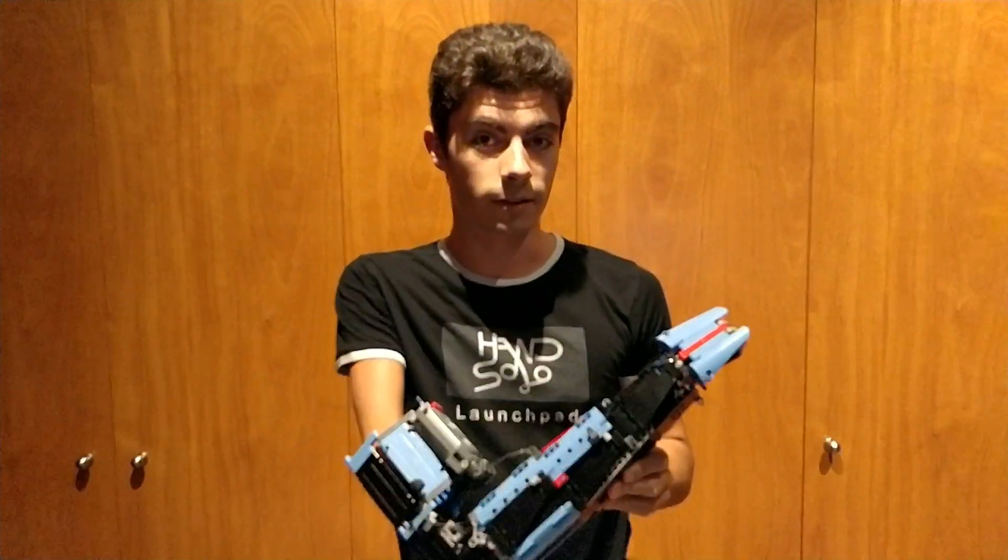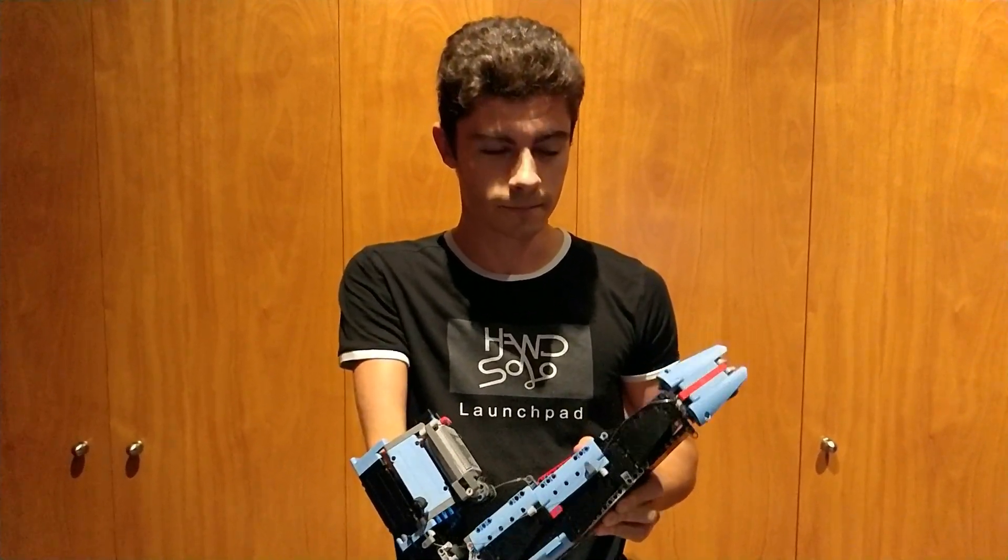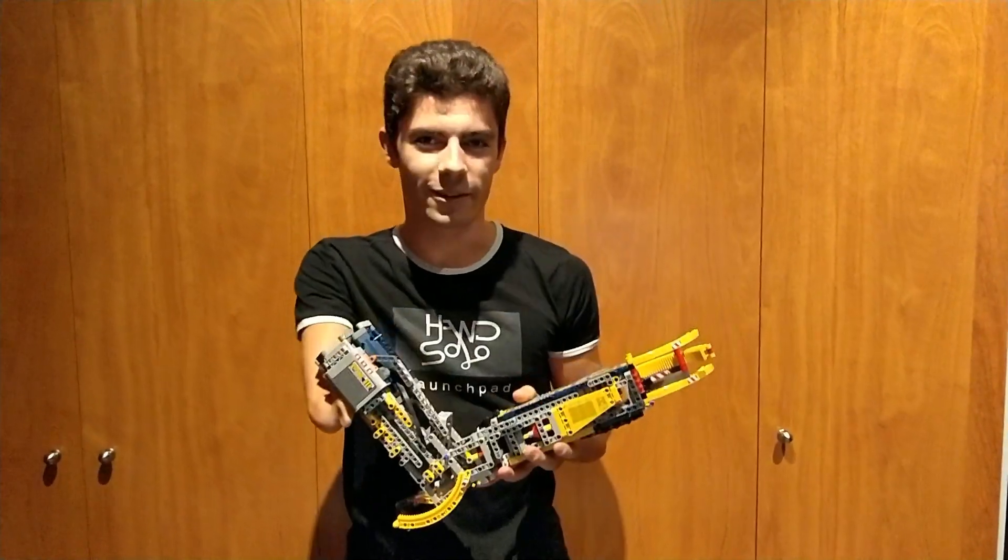Now, I'll show you the second one. But a few days ago, I started building the third one. And here it is!